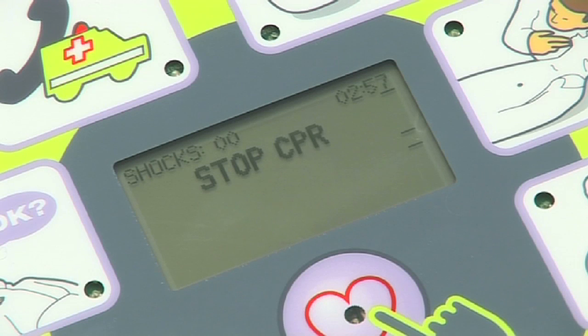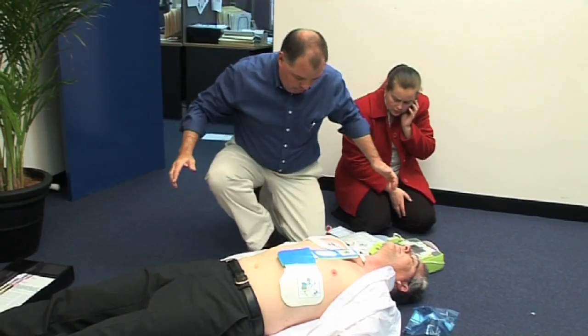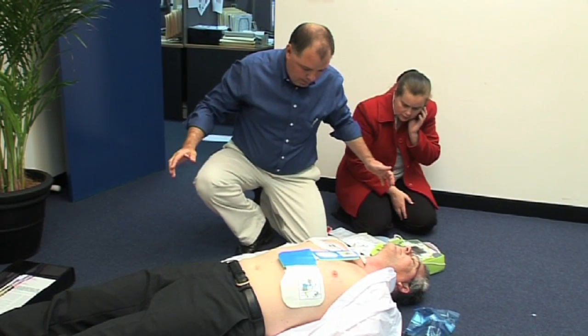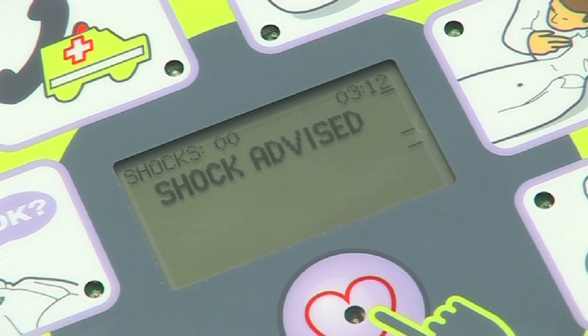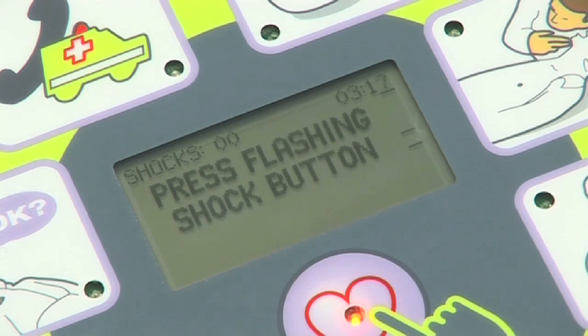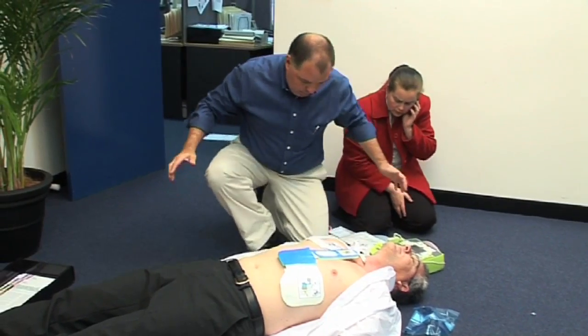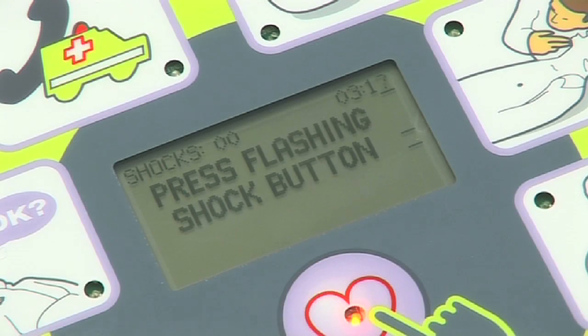After two minutes of CPR, the AED Plus will then analyse the patient's heart rhythm. If the device advises to administer a shock, you must ensure that no one is touching the patient. Shock advised. Prior to pressing the flashing heart symbol in the centre of the device, the operator must call in a loud clear voice, Stand clear. When the rescuer and all bystanders are clear from the patient, press the flashing shock button.